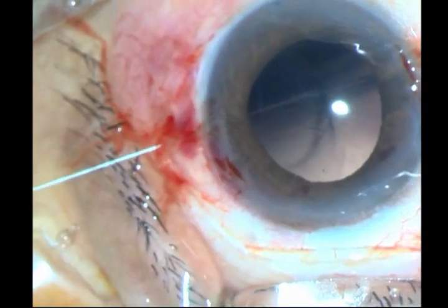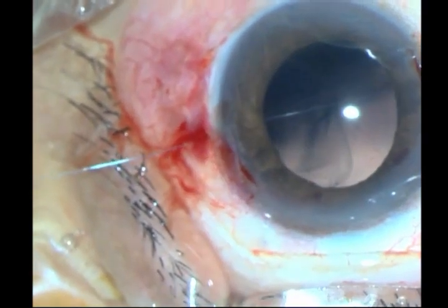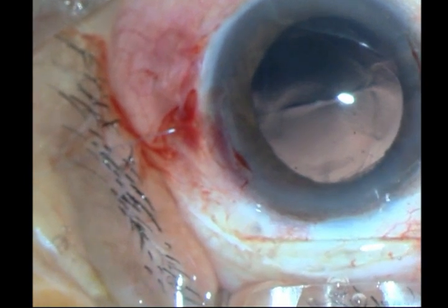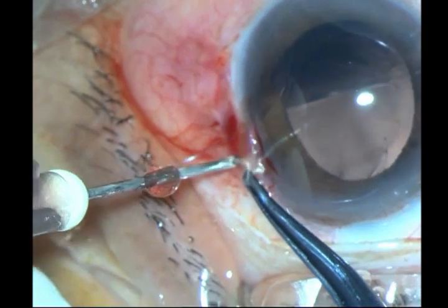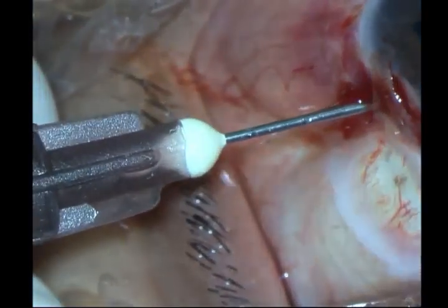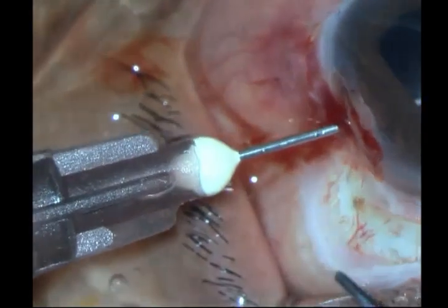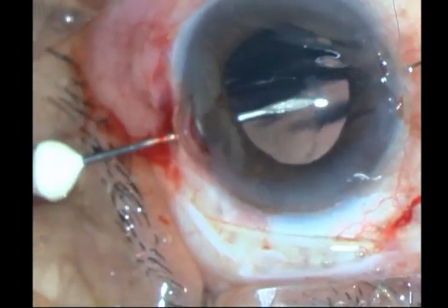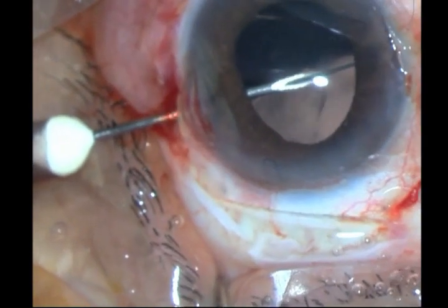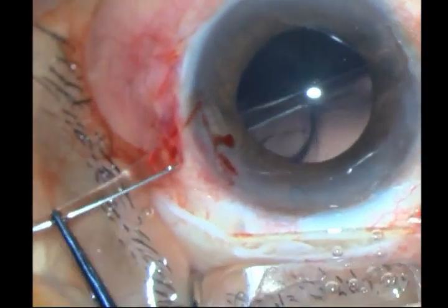You can go one to one and a half millimeters, whatever. So that is one suture done. I have to get the other one as well. Just pressurizing the chamber with some HPMC. It is very difficult to put these needles and sutures in these soft globes. You have to go vertically down and then turn. I have my 26 gauge needle through behind the iris, and I am coming around with my scleral suture. Good thing I was able to thread it immediately. Bring it out — and that is done. One really difficult part of the surgery has been completed.